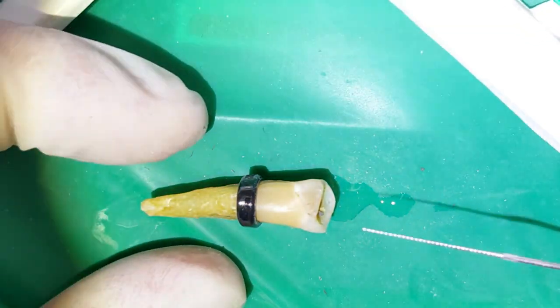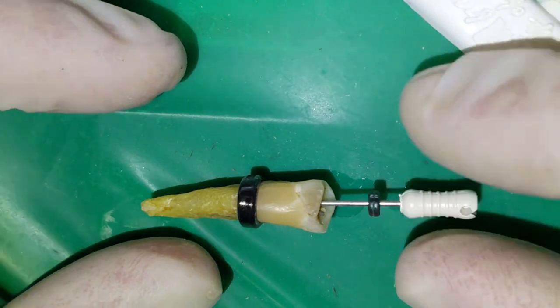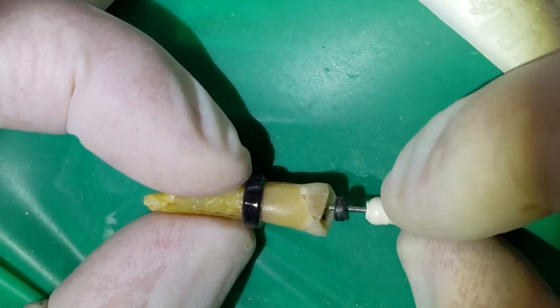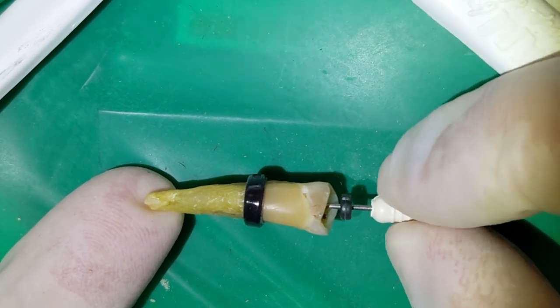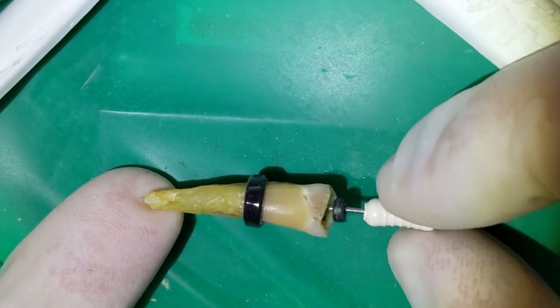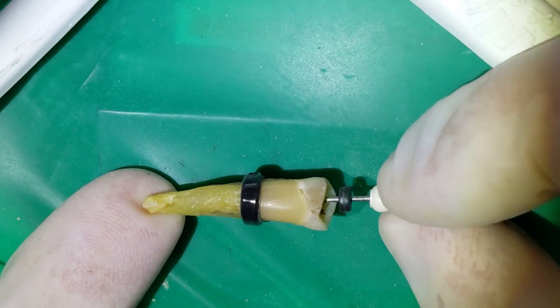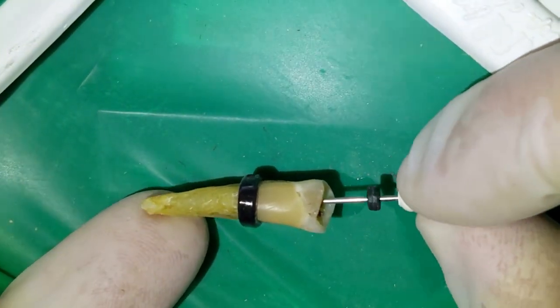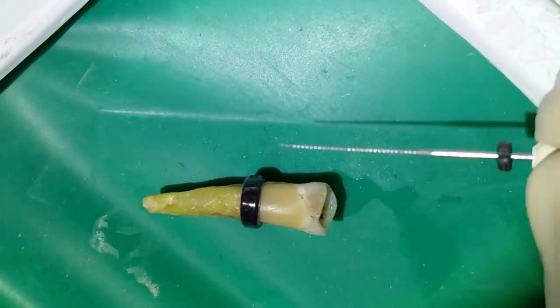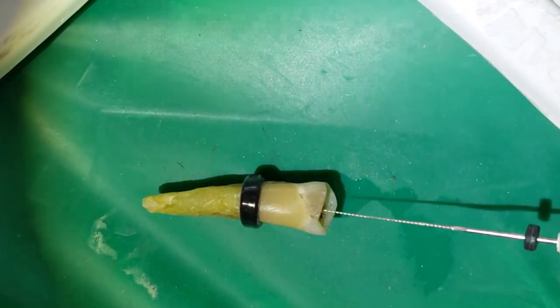And one last double check. My number 15. We'll make sure we can get it out the root tip. And there we go. There it is. See it? I'm going to pull it in and out a couple times. So we're not blocked in. So this way, once it's all cleaned out, we can put the root canal sealer material in and it'll seal the inside of the tooth.